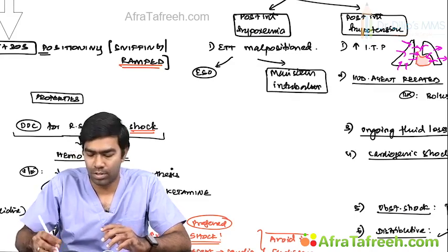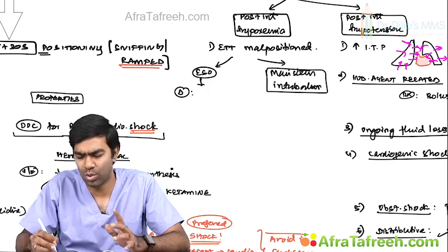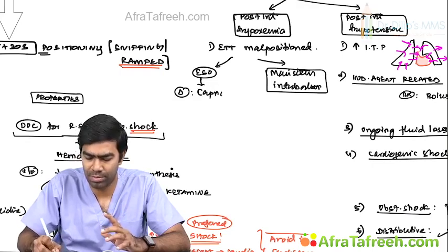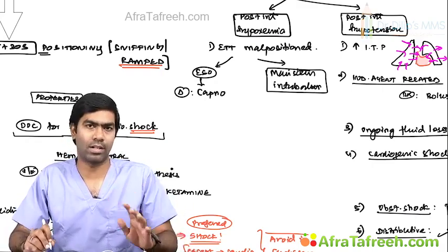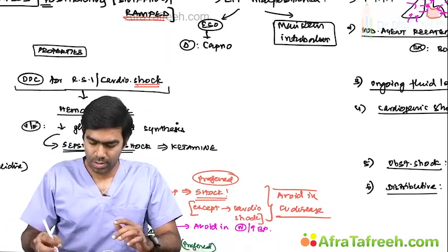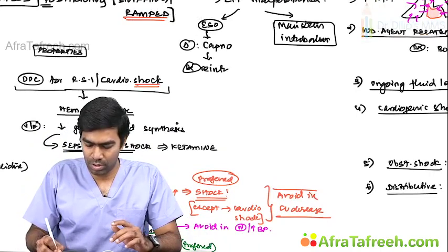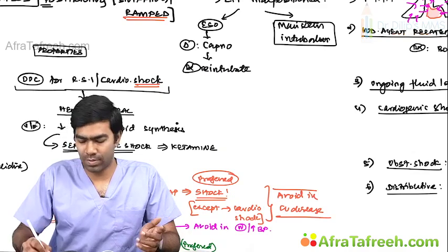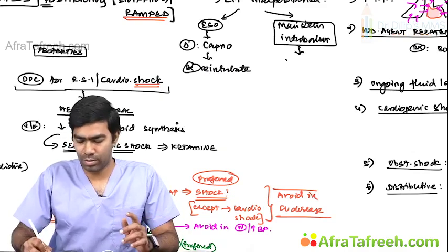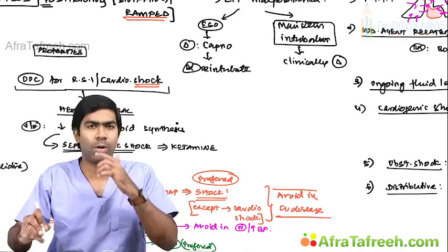So it's very simple. Identification, diagnosis of esophageal intubation is usually by capnography. Capnography is the gold standard for this, except if the patient is in cardiac arrest. What will be the treatment? Re-intubate the patient. You take the tube out, there is no other option, you have to re-intubate. Mainstem intubation is very simple. You are going to diagnose clinically. This is the most important concept.